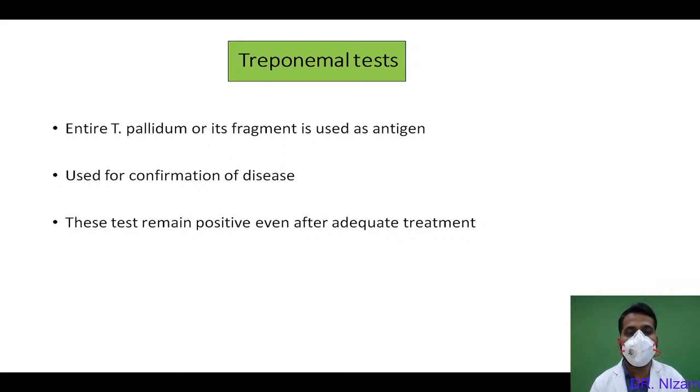Then coming to the treponemal test, why is it called treponemal test? Because here the entire treponemal organism or a fragment of it is used as an antigen. It is used for the confirmation of the disease, and the important point is it remains positive even after adequate treatment, which is not true for the non-treponemal test.